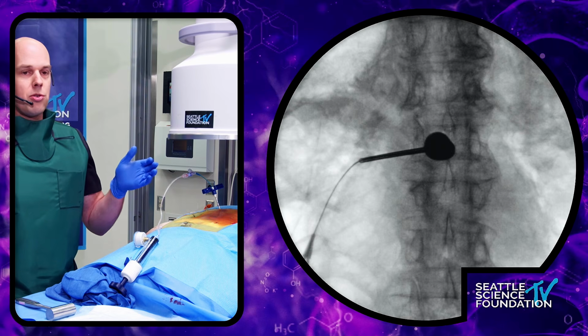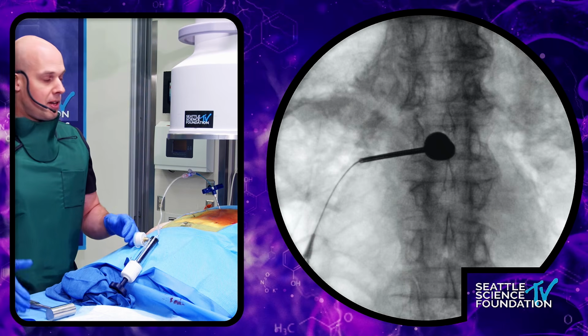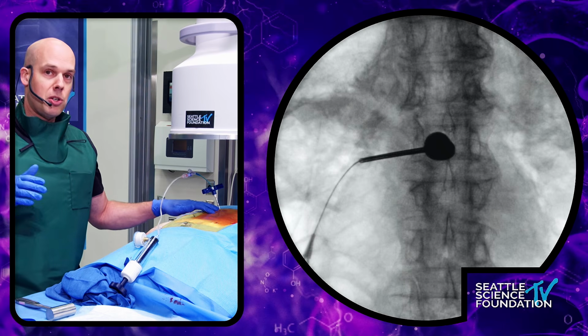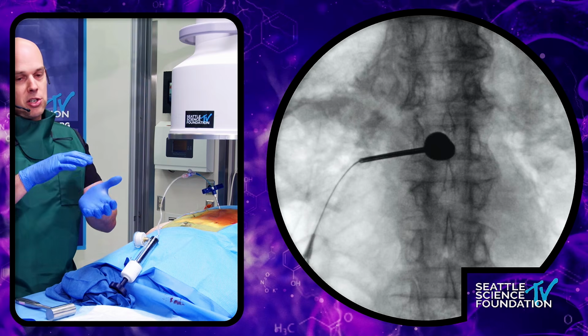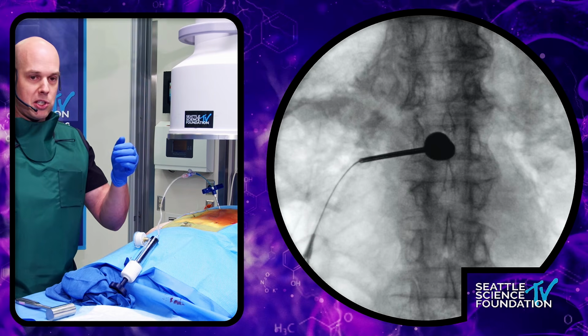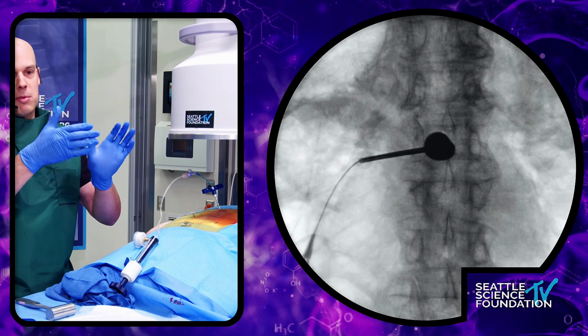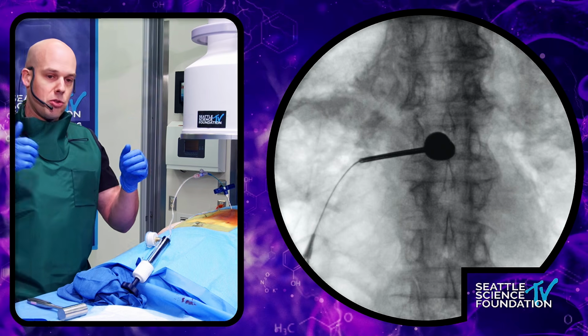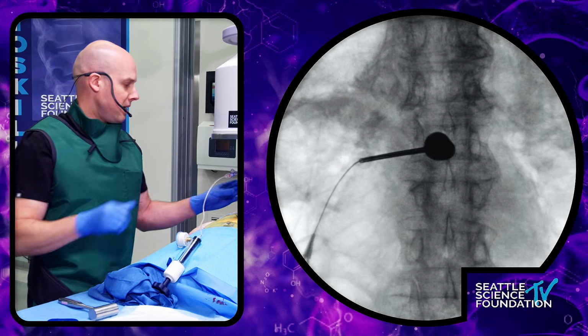So much easier to know when to stop. And the other thing, whenever you use a bipedicular approach, one of the problems with homogeneous cement is that when you're on your lateral with the second pedicular access, often you have a complete shadow of the cement amount. This allows you to see through the cement that you already injected.